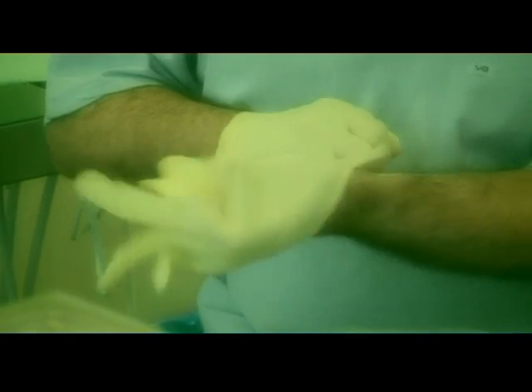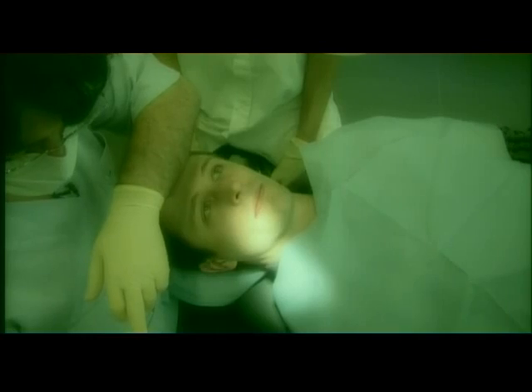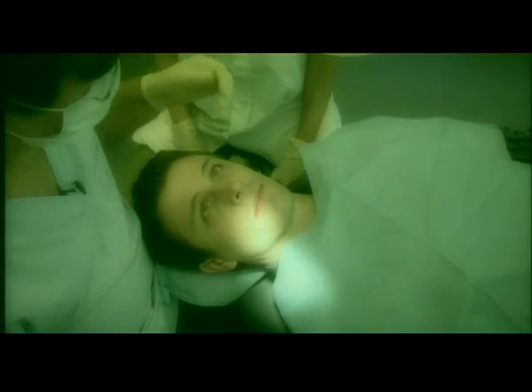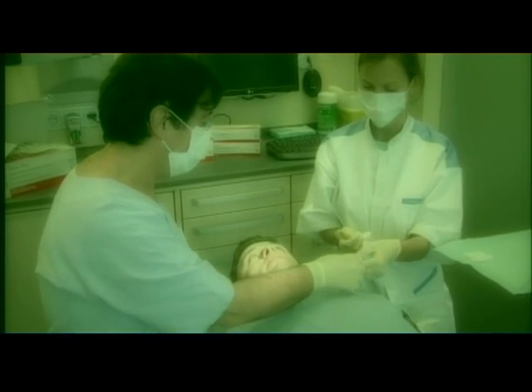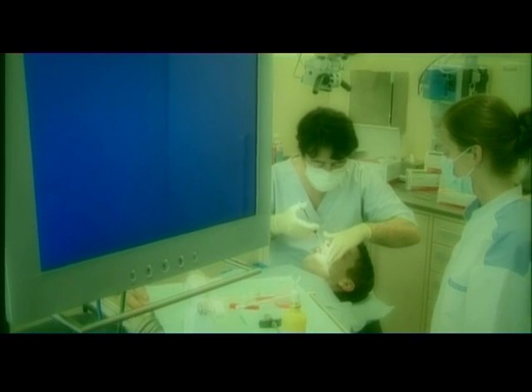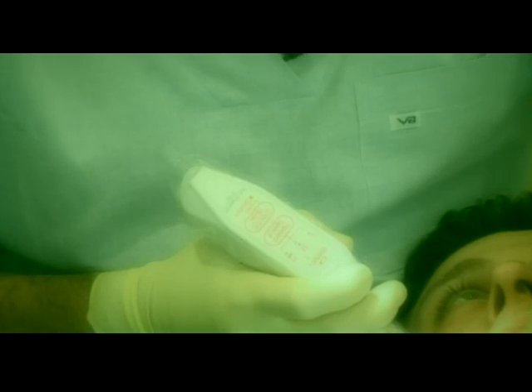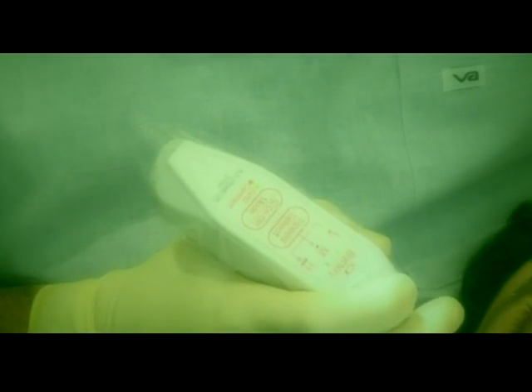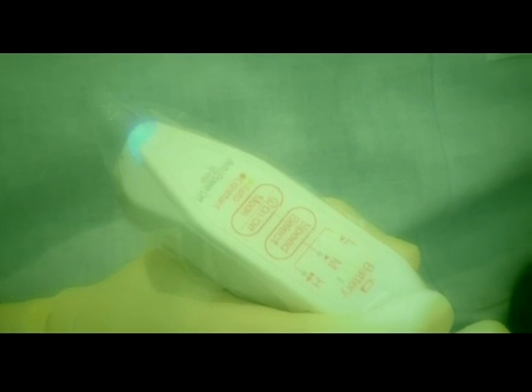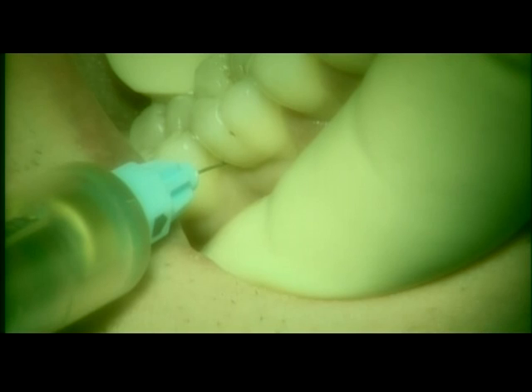This is especially important for inferior alveolar block techniques, given the muscles and mobility of the lower jaw. Delivering the solution in the right place is only the first step. You must also ensure that it stays there. In the future, we will all be using automatic injectors as they give precise control over the speed of injection.